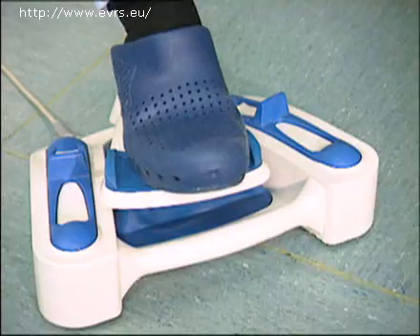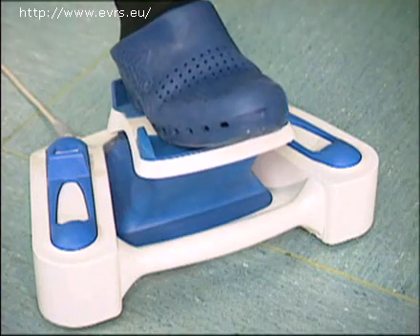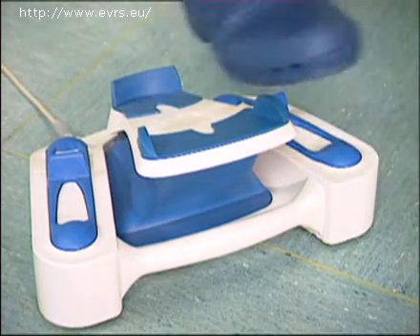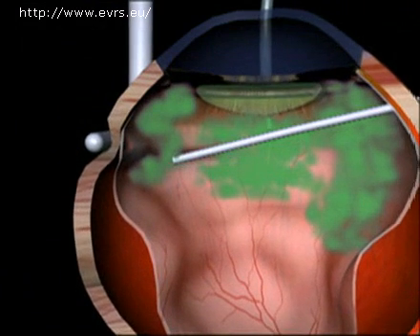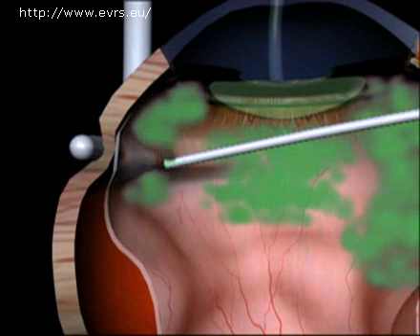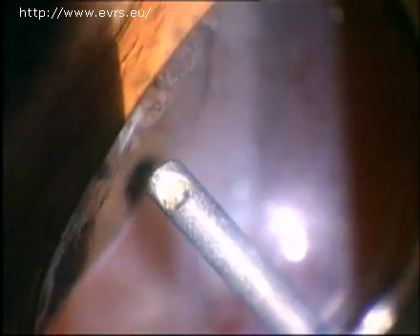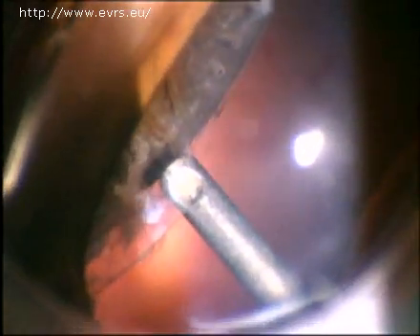In these cases, it seems better to change the program, as we do while putting a car in first gear, opting for a low aspirating flow program with a maximum aspiration flow of 6 cc per minute. The operator will then have the entire pedal range to go from 0 to 6 cc per minute in trying to execute a precise and complete peripheral vitrectomy. In this case, things are easy, so we work at 6 cc per minute.